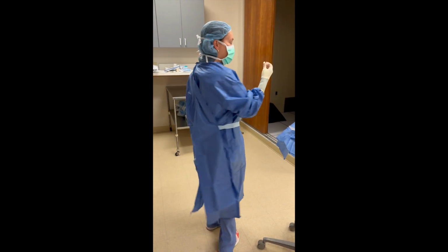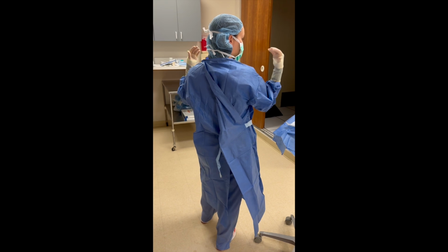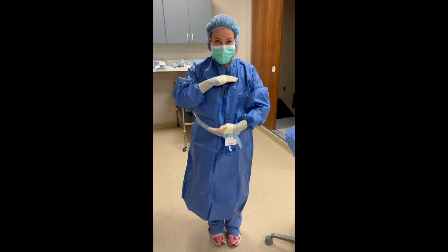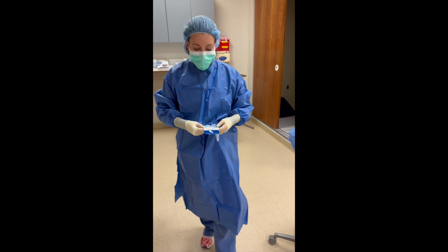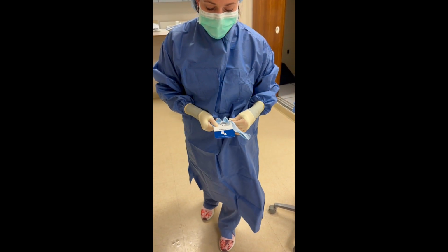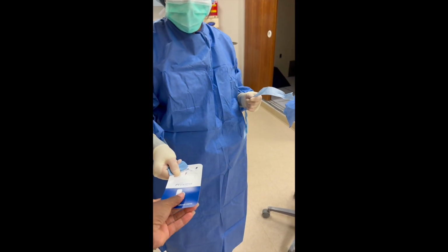Somebody has come in and tied the back of my gown and tied the neck. You are to never do this yourself because you're contaminating. Technically, right now, your only sterile field is below your collarbones and above your waistline, okay? So notice I have a tab here. Read the tab. It tells you the assistant grasped here, so the assistant gets the blue. I keep the little baby string right here, is what I like to call it, the baby tab, and I hand this off to the assistant.